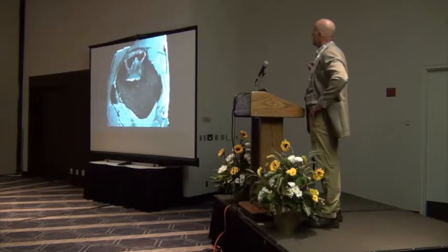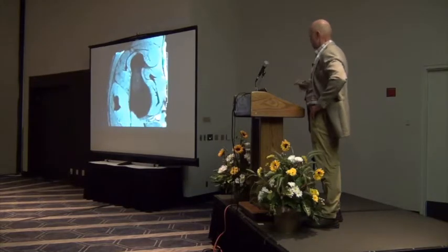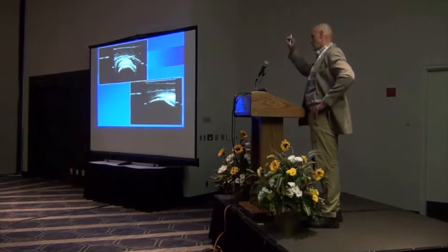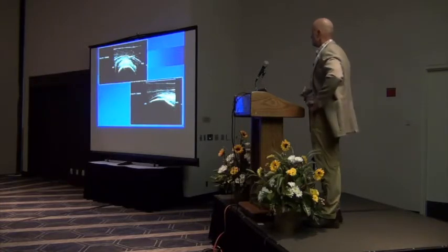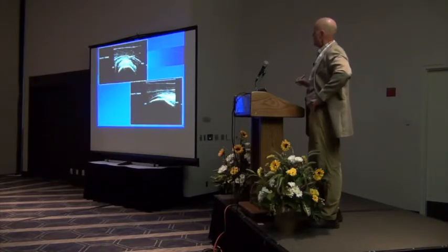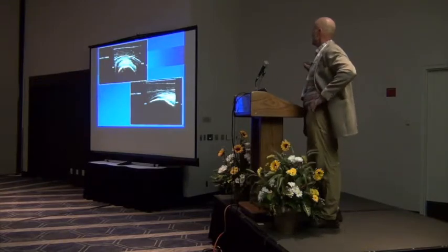So here we are, a little bit of muscle on the top. That's normal, and when you scan some of these horses, you'll see a little layer of muscle on the top. That's not edema. That's probably a normal structure, the remnant of the biceps muscles that comes up on that cranial face of the biceps tendon.